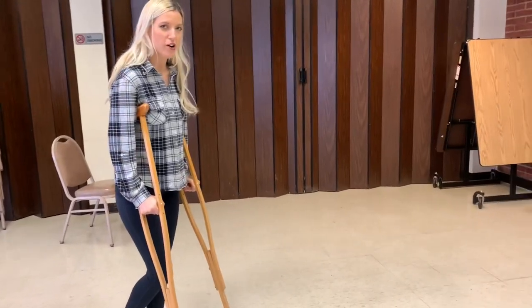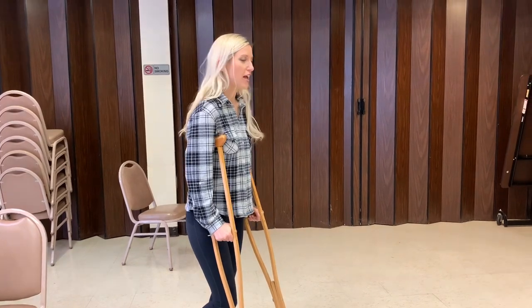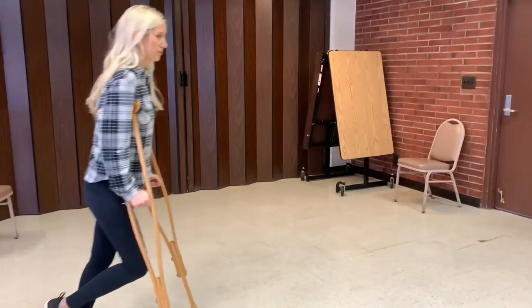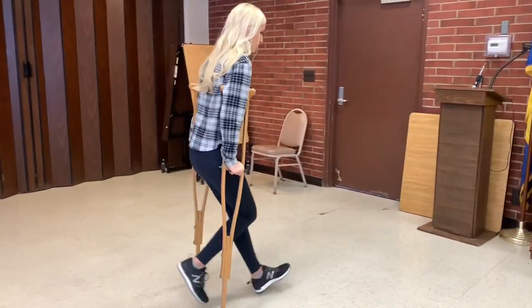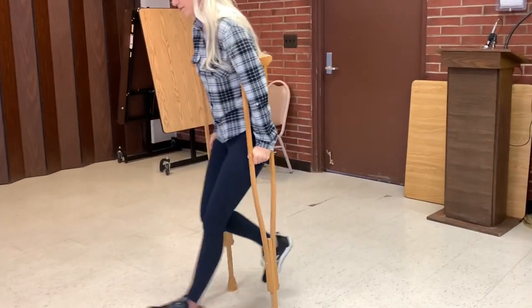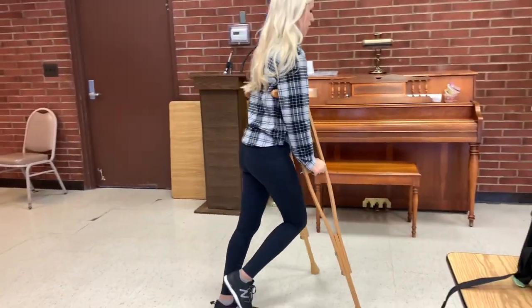So when you're first starting out, it's difficult to remember to look ahead, but you want to look ahead and not look down at your feet. And it's just like driving a car, so you'll keep your eyes on the road. And as you get more comfortable, you will get faster on crutches and you can take longer strides. So we always tell patients to be very careful on crutches, especially if it's raining outside or icy out, because that's something that can just cause the crutches to slip right out from underneath you.